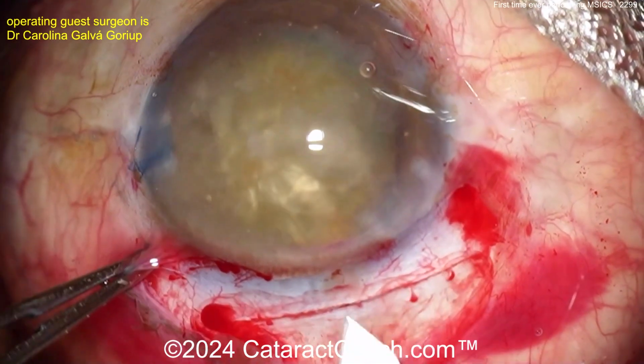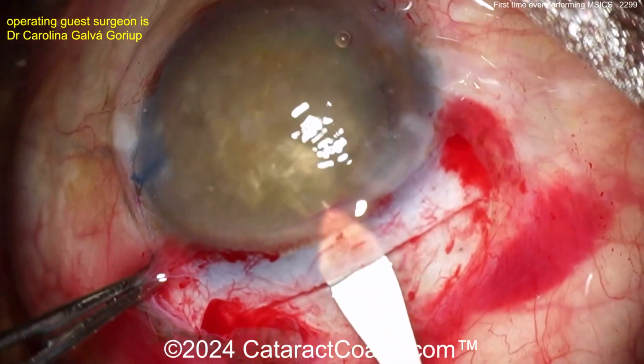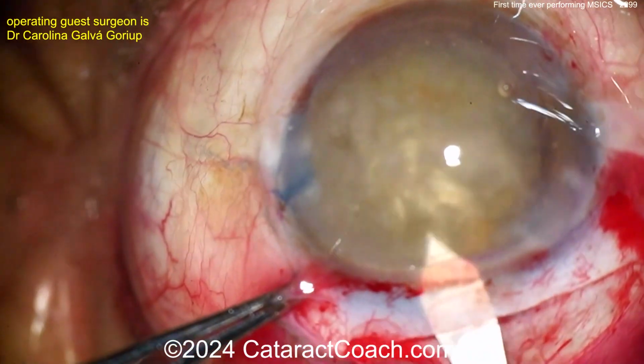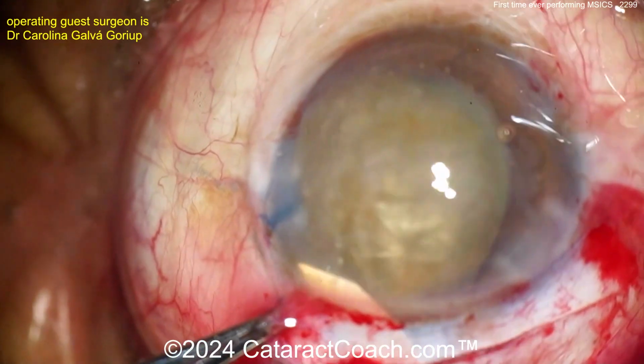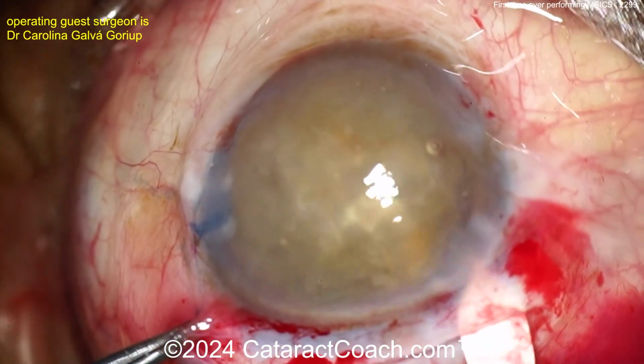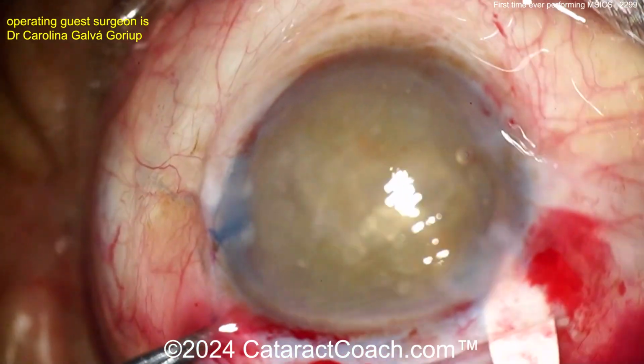Now you can open up your incision here. So going in with the sharp blade, entering the AC, you need to just enlarge this all the way. And you want to make this kind of trapezoidal, so it's wider on the inside, a little shallow on the outside. And now you're going to express this thing.